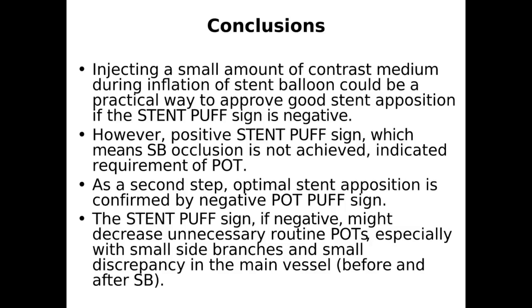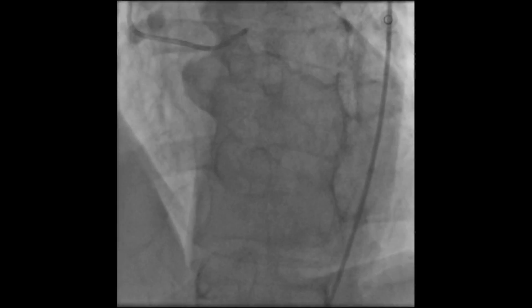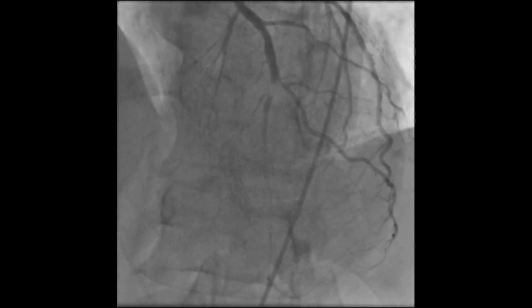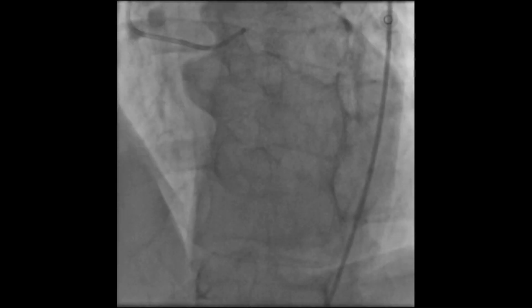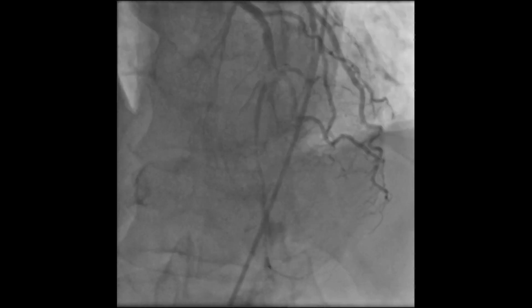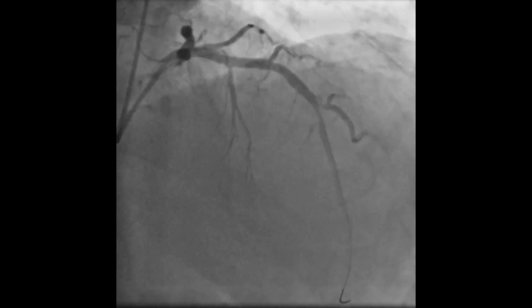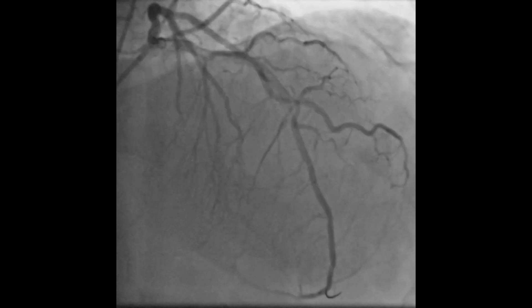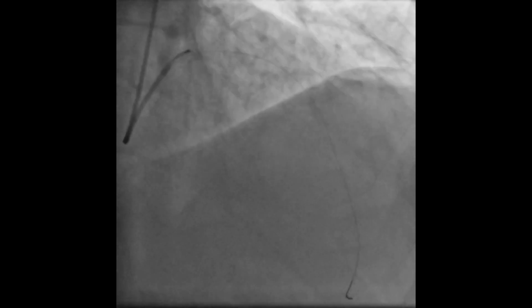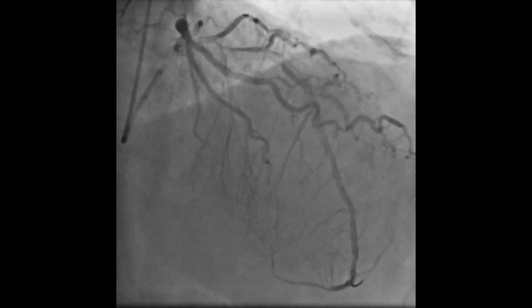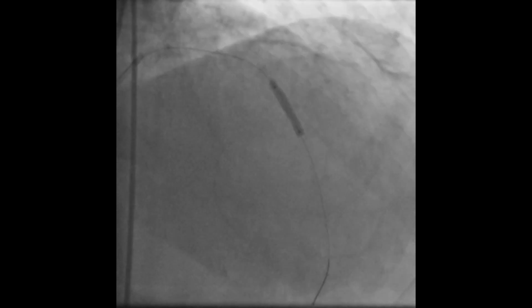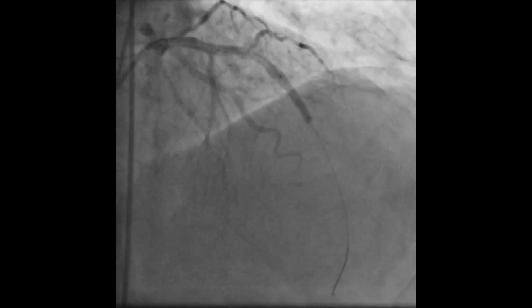There are two stages. In the first stage, if the stent puff sign is negative, we don't need any further intervention. If the stent puff sign is positive, we have to perform POT. You can now see the angiographic images where we applied POT — this is the stent puff technique with a positive result, meaning POT is necessary as the second step.